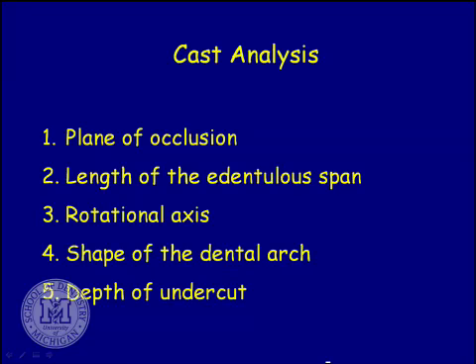So look at your plane of occlusion. How long is the edentulous span? Again, many times the edentulous span is fairly short. One of the things you're thinking of is, what if I just do a fixed partial, a bridge? There are some situations in which the edentulous span gets longer. The amount of stress you're going to potentially put on your abutment teeth if you do a fixed partial denture is a lot, and so those may fail over time. You might not just trash the teeth.